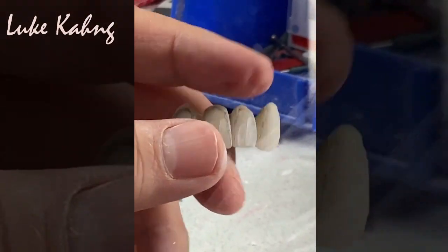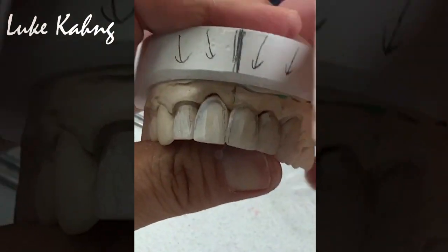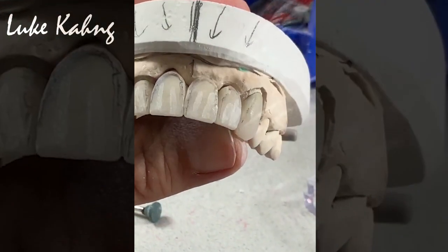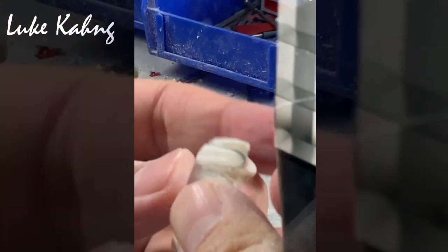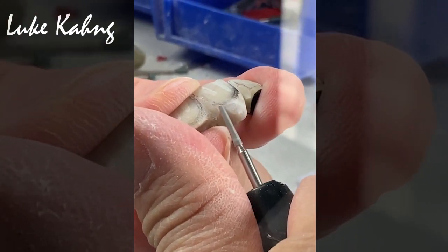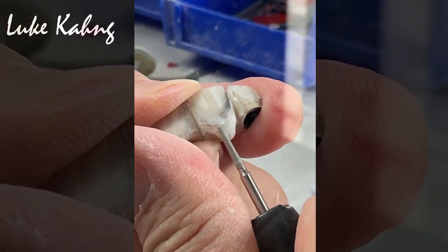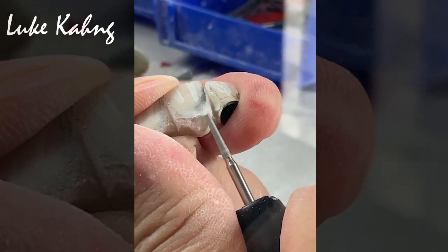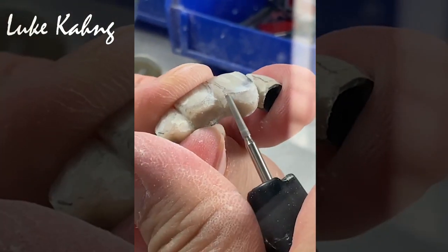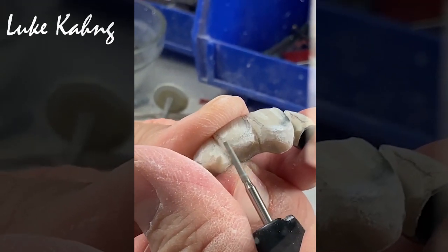Then be back. Just make sure the canine to canine. Alright, and then size of the tooth. And then the last, you have to use the diamond, center diamond. So move here this much. So make the neck. You can either put some stain here, pink porcelain. It doesn't matter. Depends on the patient, depends on the doctor. So we get the better.